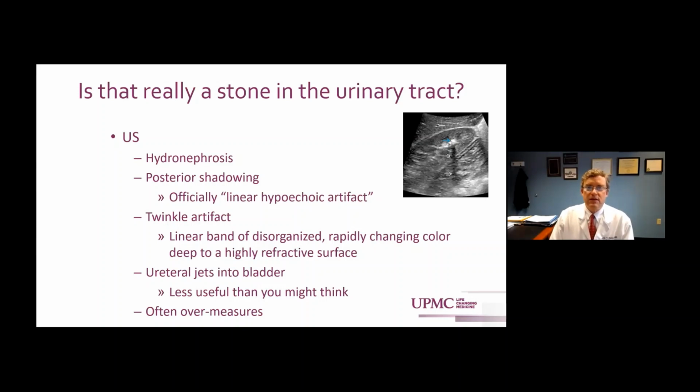Twinkle artifact is what you'll see on the Doppler views. It's a linear band of disorganized, rapidly changing color, which is reported by our radiologists not infrequently when they say, well, there's a hyperechoic area, there's no shadowing, but there is a twinkle artifact, so we think it could be a stone. Again, something that clinically you may have to evaluate further.